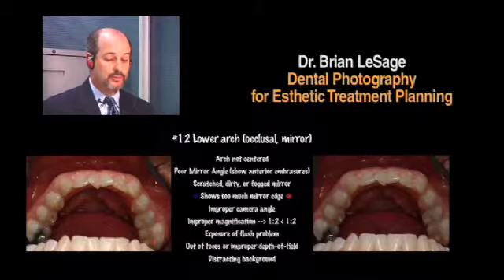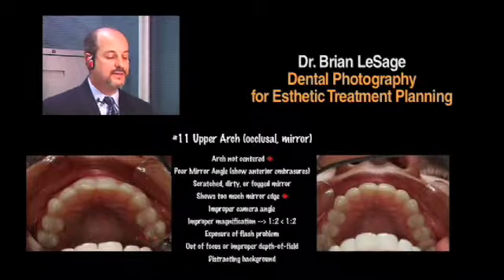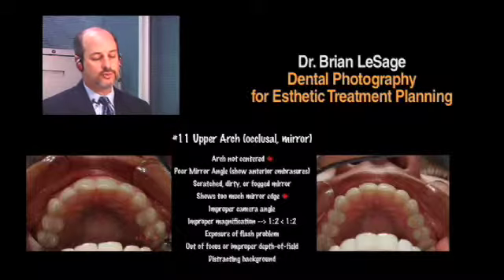This is a better view. Let me just go back here one second. Here's the key to this view, though. We're really trying to diagnose this facial surface and the arch form. So you don't want to have the lip on the teeth, and I want to be able to see the facial embrasures. That's really the key to this view.